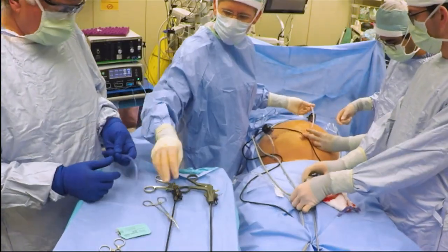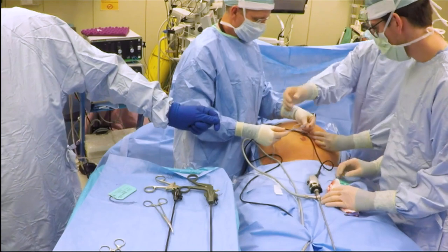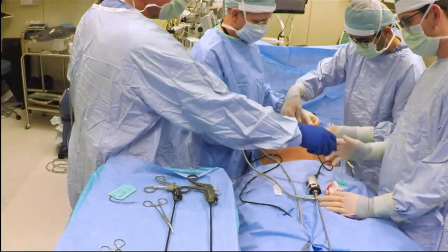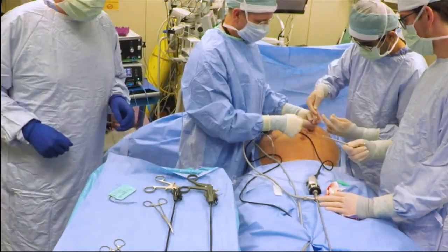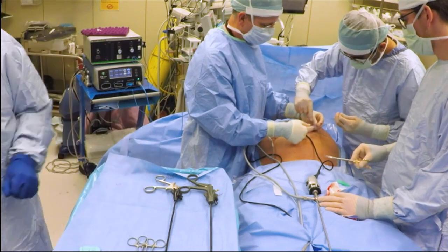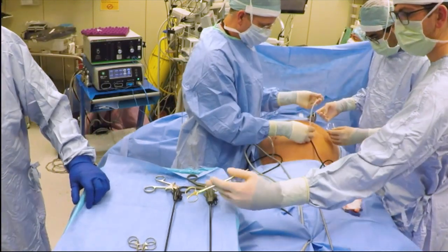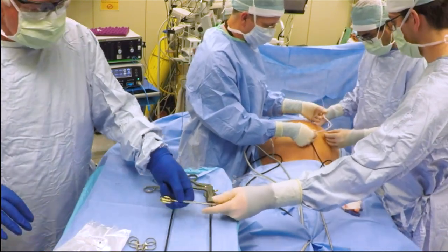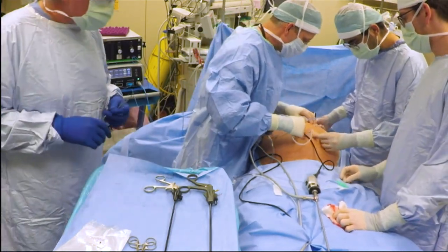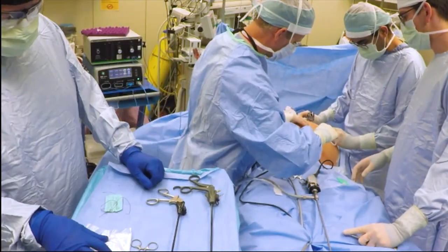We then connect an antegrade faller trocar to our catheter and secure it with suture. The catheter will be tunneled to an exit site which is lateral to midline with a curved downward facing slope, which reduces infection and ensures optimal placement.